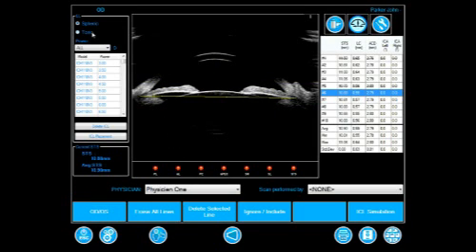The operator will be able to simulate a posterior phakic IOL using the recorded data. He selects either a toric or spherical lens implant.